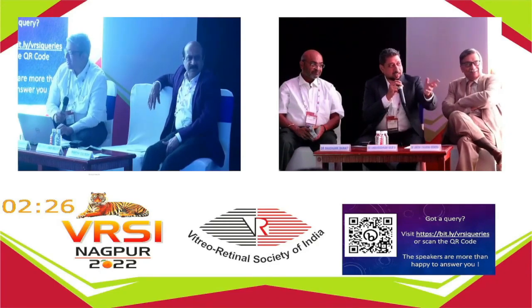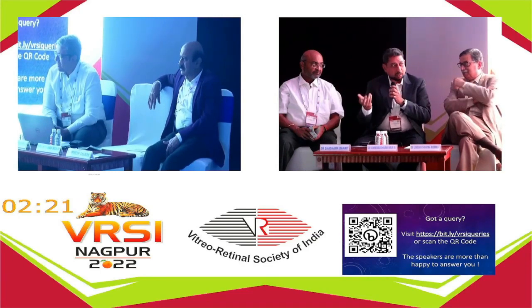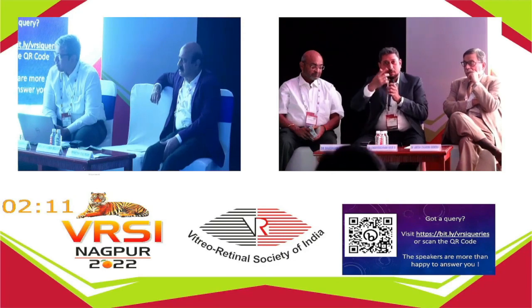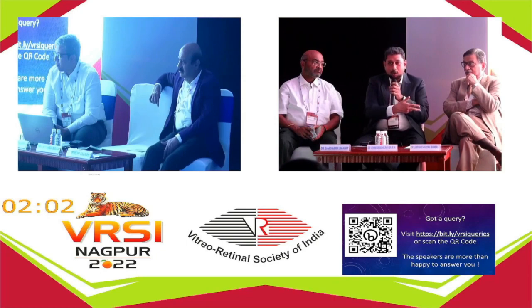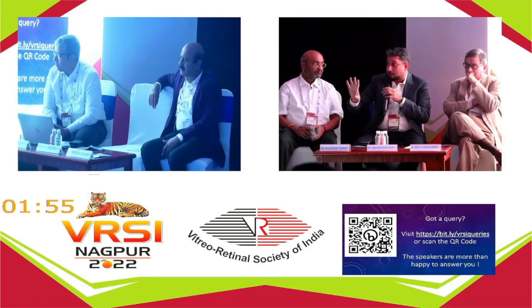I would just like to make a point. The 3D systems are technology forward, but the ergonomics are not sorted out. Let's be very frank, you're still looking away at an angle, and you still have ergonomic problems with it. One of the most important equipment in our lives today, which I can compare it to, because it doesn't give you that much, is a treadmill at your home. You hang clothes on it. In a lot of OTs now, you find the 3D system on the side and people hanging things on it because they're not comfortable with it. The ergonomics are not perfect now.